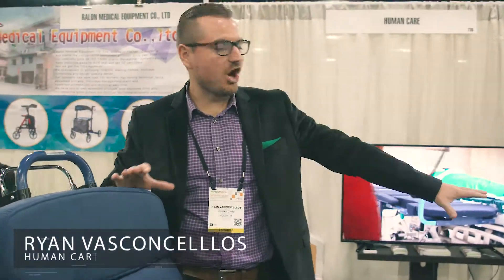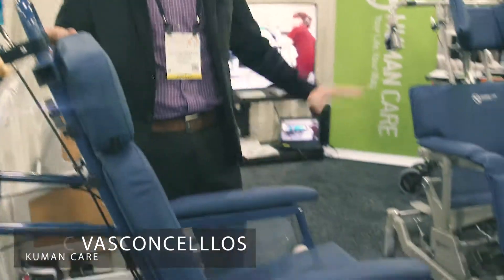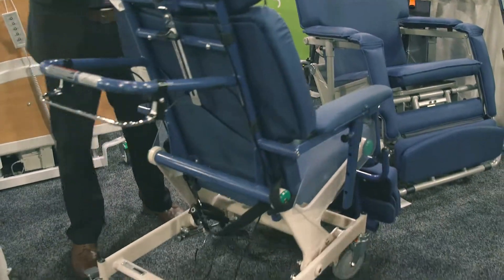So these are our convertible chairs. This is the 250-pound model, and that's the 400-pound model. I'll give you a quick rundown of the functions — very simple.